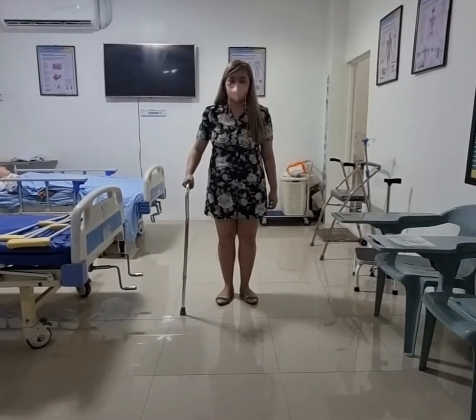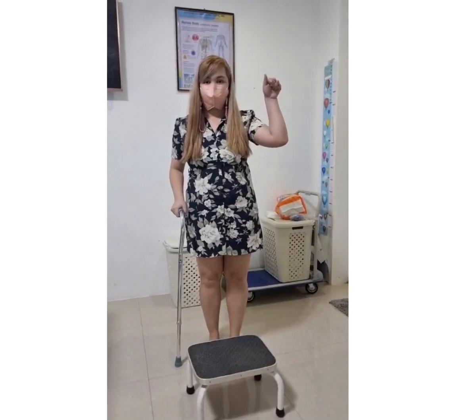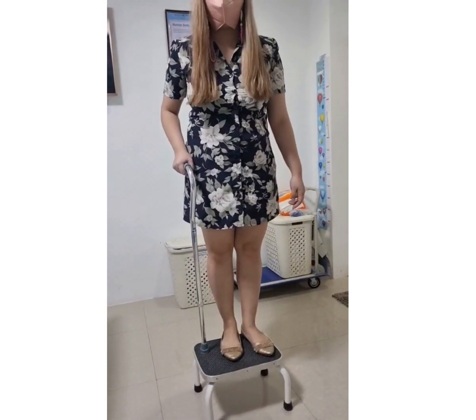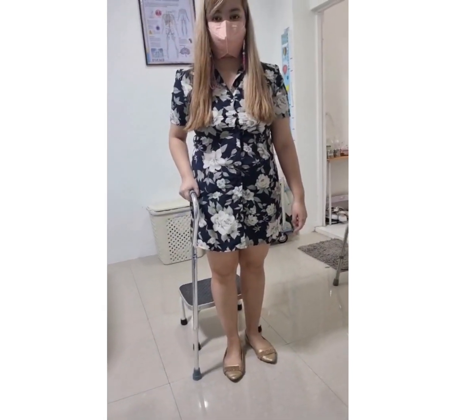So, hindi pa po nagtatapos dyan sa flat surface. Meron pa pong going up and going down the stairs using cane. So, always remember, good leg goes to heaven, bad leg goes to hell. Don't leave the weak leg behind. It is always with the assistive device para hindi kayo malito. So, in going up, ayan, and going down, ganito po. So, good leg, bad leg with cane. Pababa, bad leg with cane, then good leg.